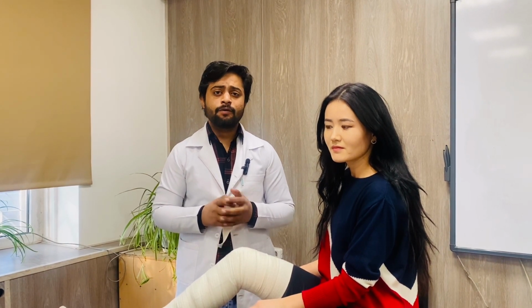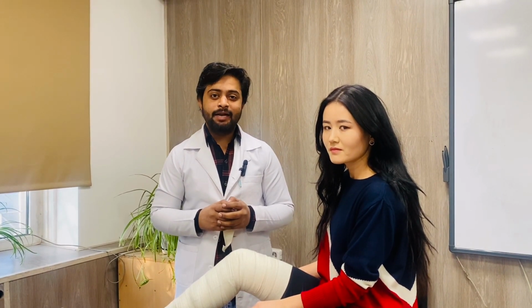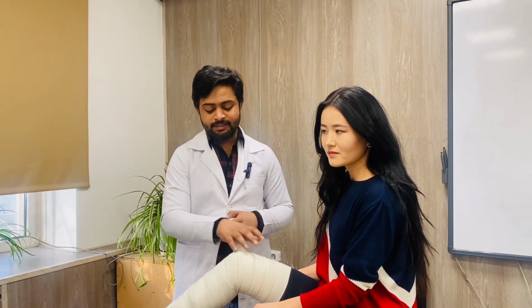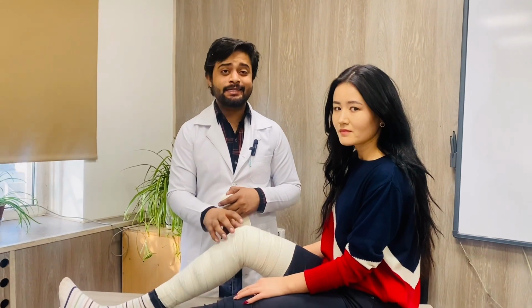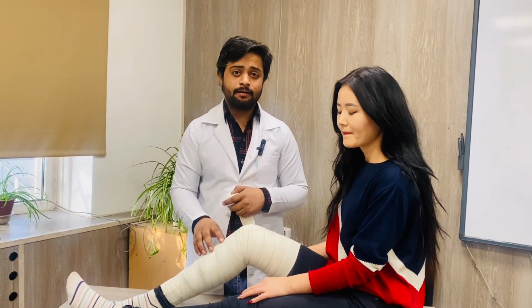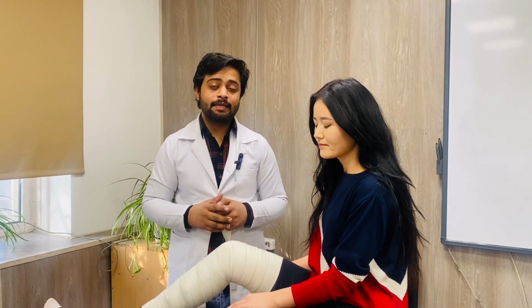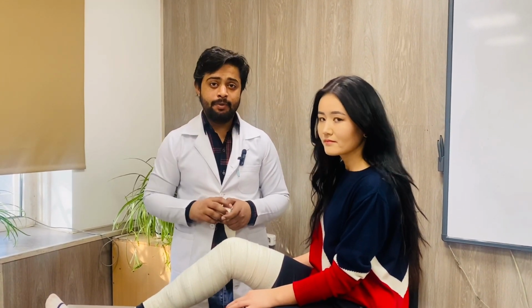In this video, we will talk about the creeping bandage or the crawling bandage. As we know very well, this patient already has a bandage, which is known as the spiral bandage, towards the leg. But the creeping bandage we do on the previous existing bandage in order to support that bandage.